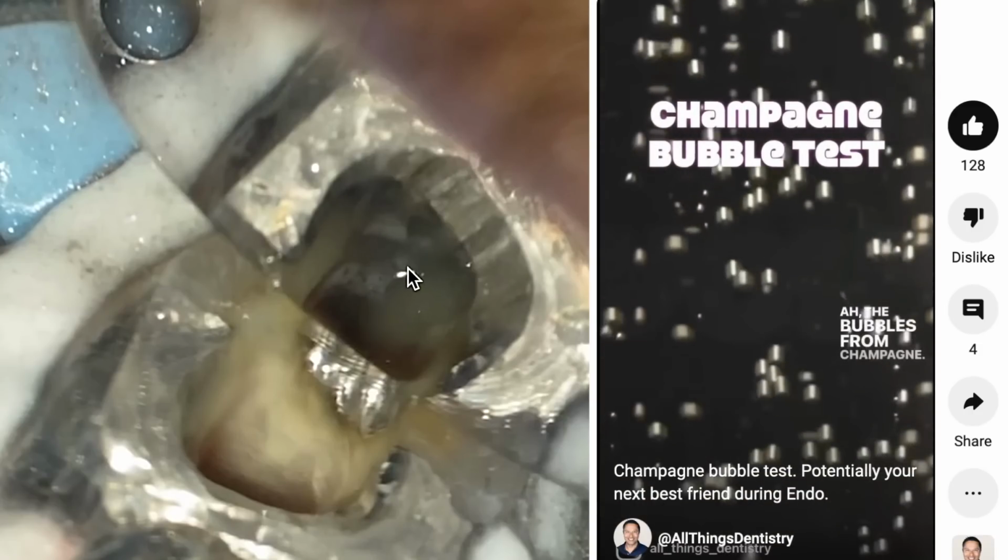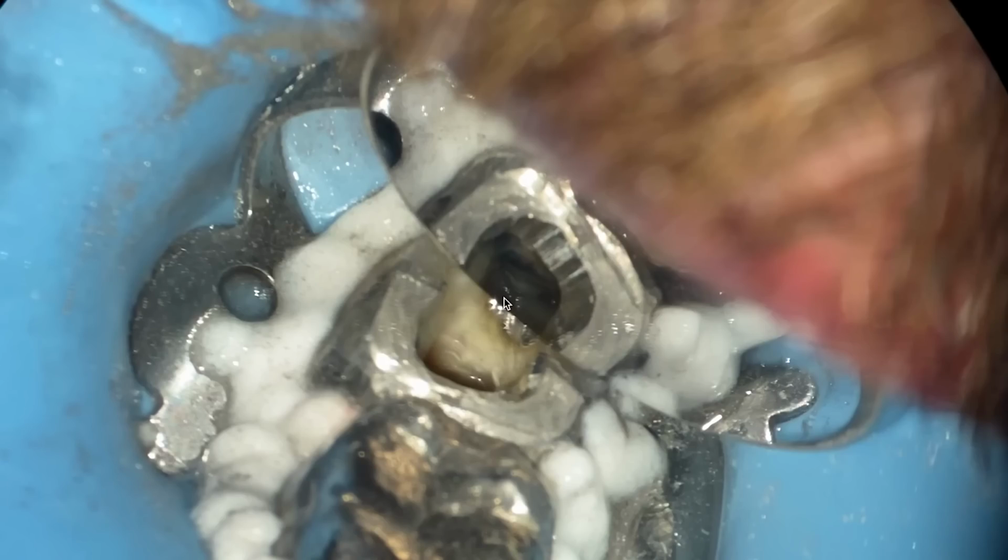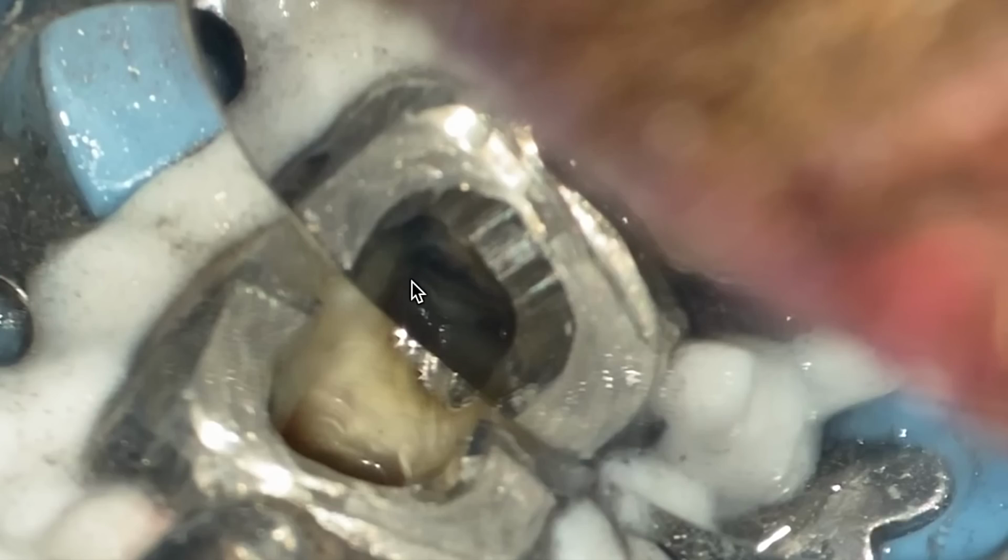I have a video on the champagne bubble test. This is a quick champagne bubble test right here. I can see this is where the orifice is going to be. So this is what I'm talking about. Mesiolingual, boom, I can see it, no problem. That's really easy to do. That pesky mesial buccal. Oh my gosh.